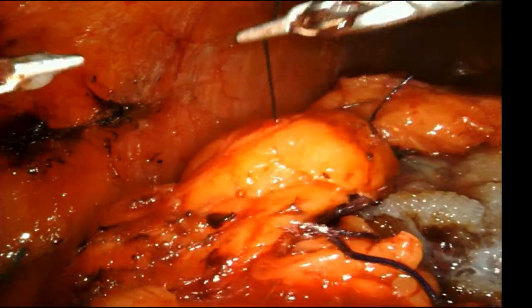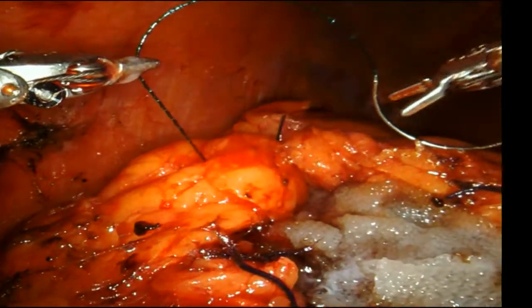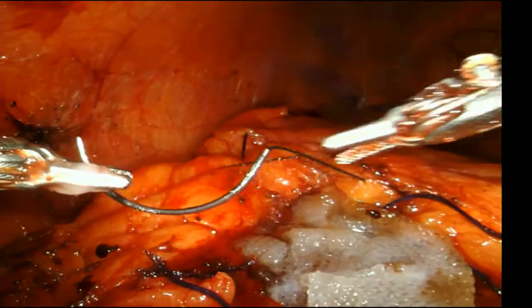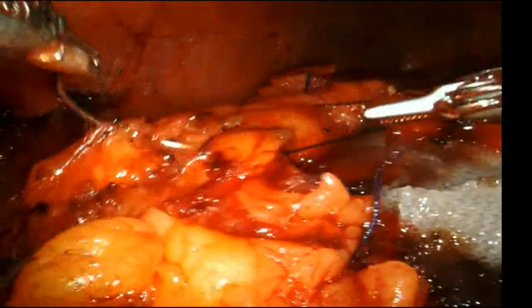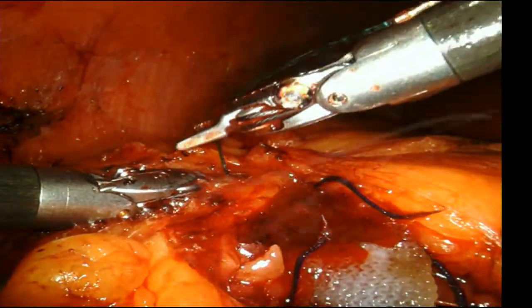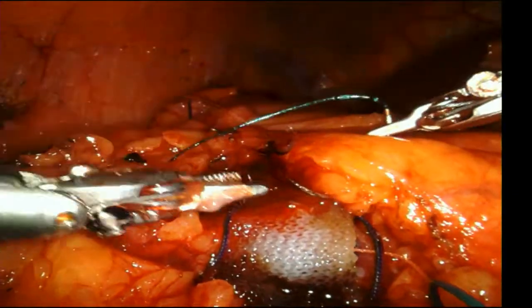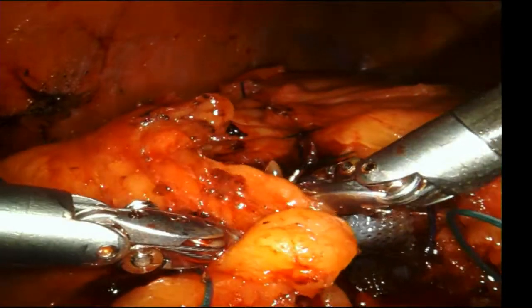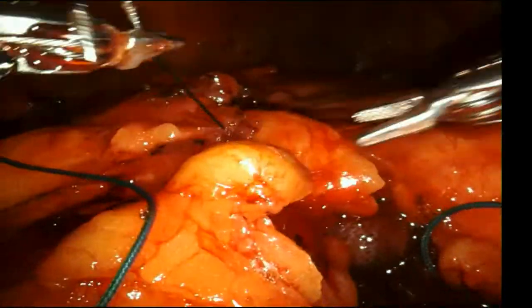So here I'm just closing the Gerota's. This is why I like to mobilize the kidney within Gerota's. The question came earlier, whether you mobilize the kidney inside of Gerota's or you mobilize the Gerota's with the kidney. This is the reason that I like to keep the Gerota's intact on the kidney, because then at the end, I'll just close the Gerota's over the top and restore this protective layer here. Kind of like when you have a renal trauma, but it's contained, you get a hematoma contained to Gerota's. I think this gives you a little bit of extra insurance. But you can't just sew fat, you have to have Gerota's, that fascial layer. Otherwise it just tears out.